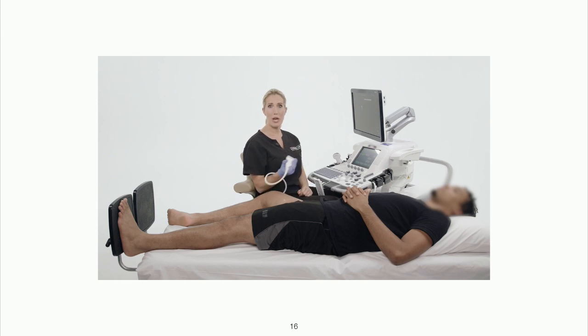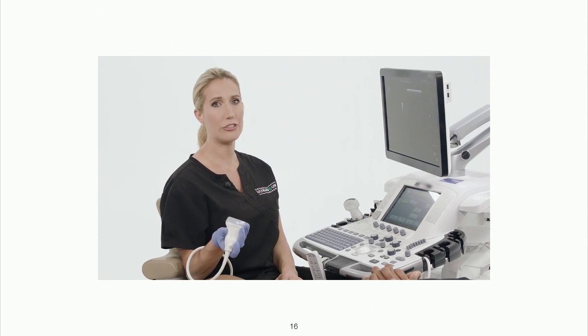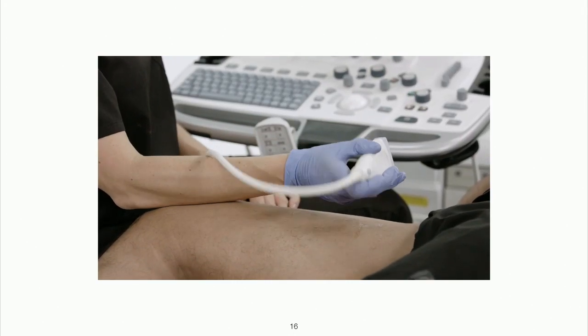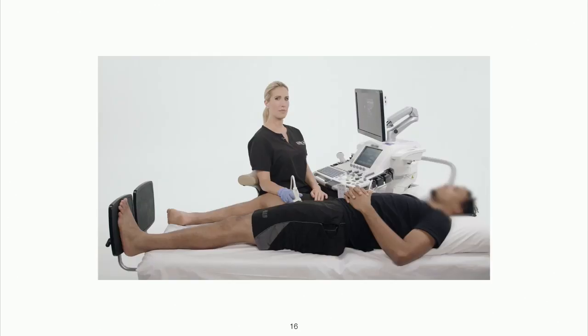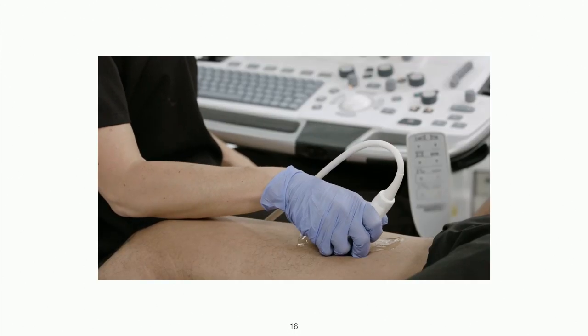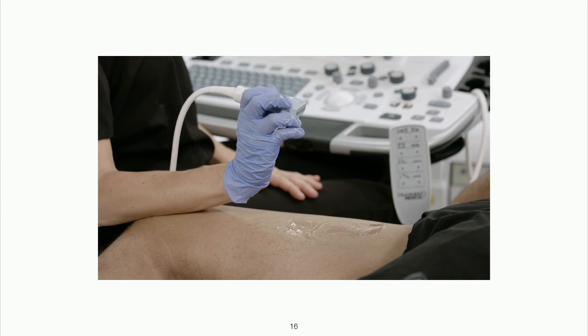I recommend to use wedges for arm support. However, if there is not one available, a natural alternative would be to rest your arm gently on the patient's lower extremity. Do not forget to ask the patient permission before doing this. Moving distally, we must also consider the wrist. Just like the arm, it should be aligned in a natural position. Ensure that your wrist is neither too flexed or too extended. The most frequent mistake seen in the vascular imaging field is overextension of the wrist.